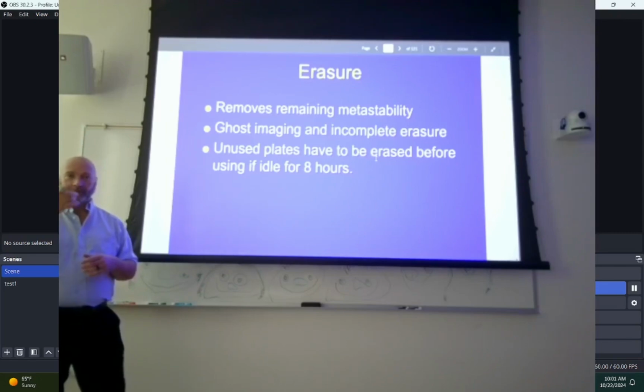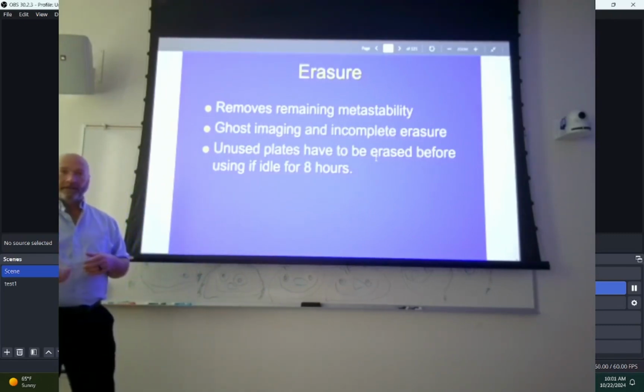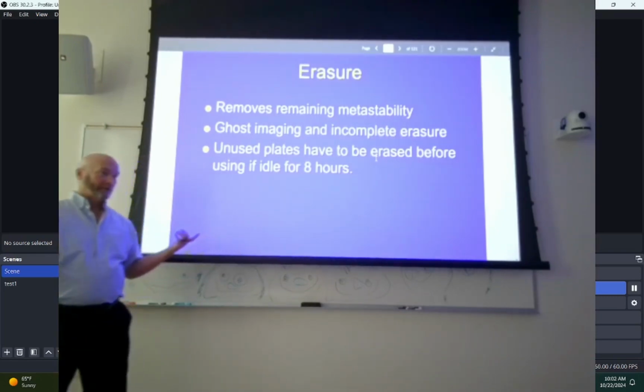Who's at UT North? Okay, so talk to him about what Jeremy did last year. He completely shut down a room for about an hour. He made an X-ray of some sort of big, thick bolt, and he used very high kVp, very high mAs. He was trying to prove penetration. He couldn't get through this thing, but he made an exposure on this thing. And for about a half an hour, they were making exposure after exposure after exposure because he burned that into the image receptor. And every image that they took after that had that bolt in the image. So it was a ghost image.